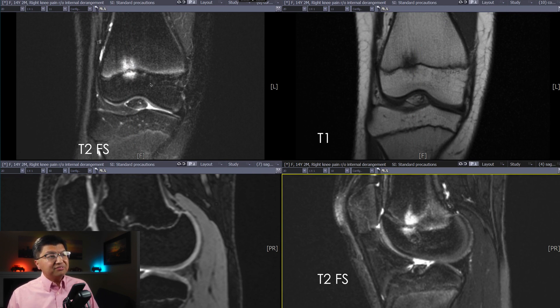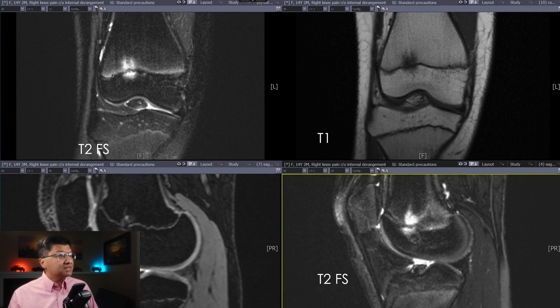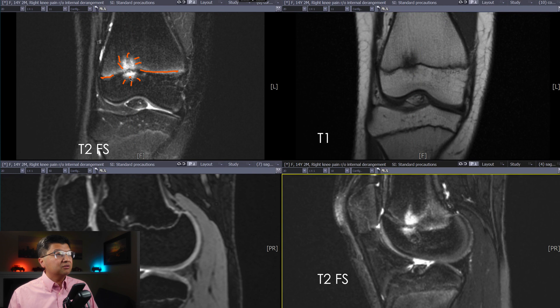In the upper left-hand image, we see a nice image of the physis itself, which is right here. But this area of the physis is a little bit more difficult to see because it's thin and you have some surrounding hyperintensity or brightness, which is edema around the physis.